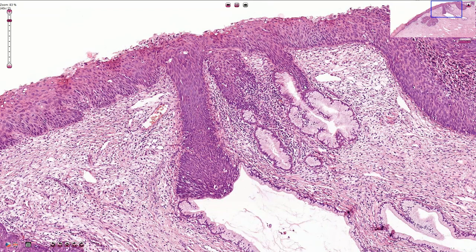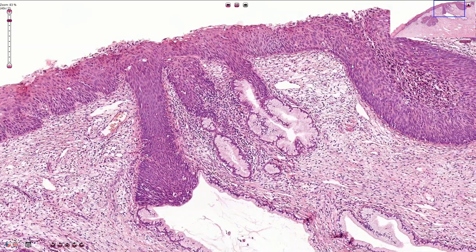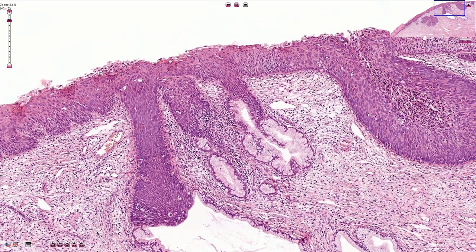Squamous cell atypia in the cervical transformation zone is typically associated with high-risk HPV infection. The squamous intraepithelial lesions are traditionally described as cervical intraepithelial neoplasia and can be differentiated into three subtypes: CIN1 is a low-grade lesion, while CIN2 and CIN3 are high-grade lesions.